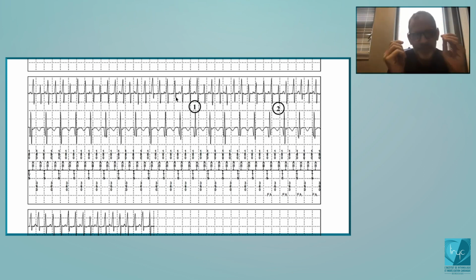Next step, is the atrial rate compatible with an episode of atrial fibrillation, or atrial flutter?